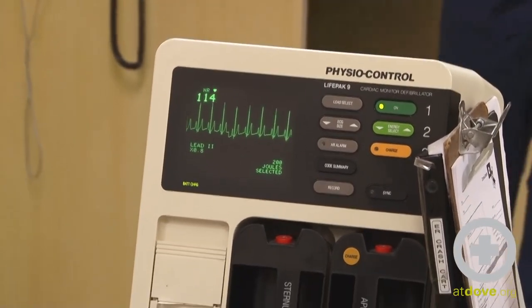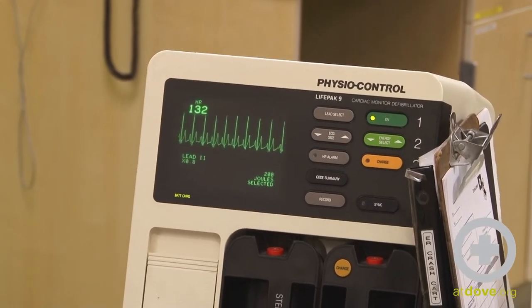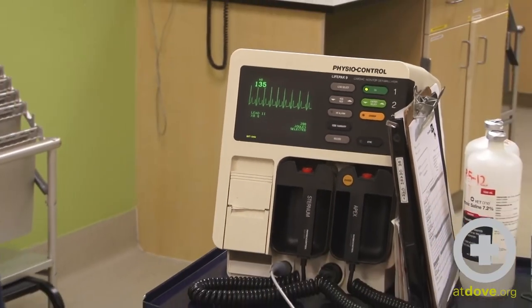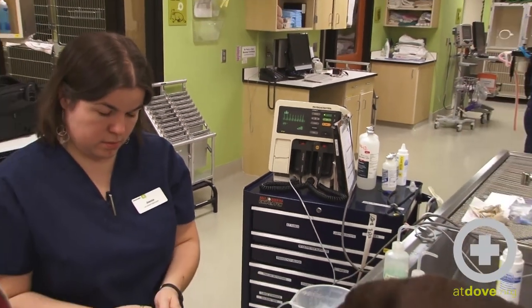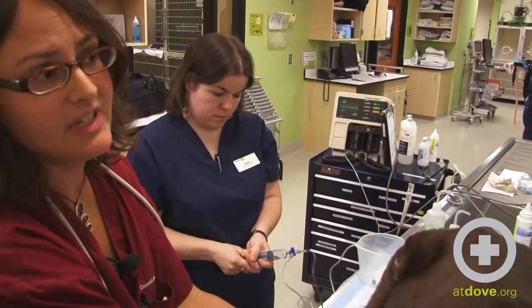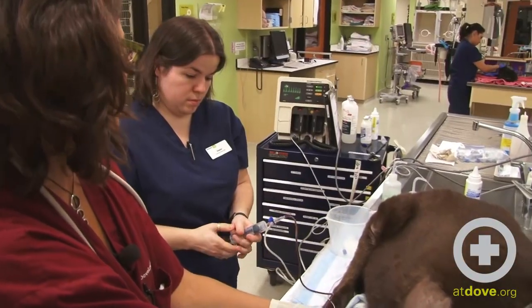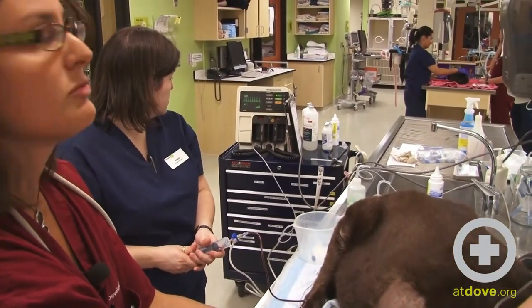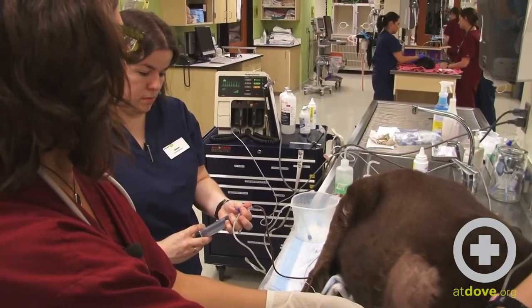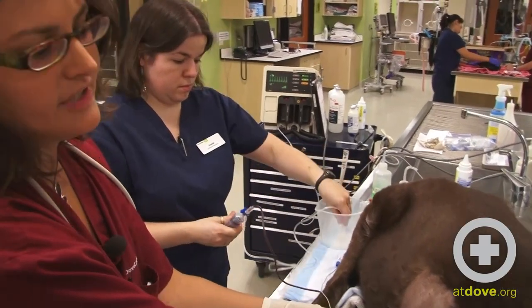We always have an animal on a continuous ECG — first of all because it allows us to see the efficacy of our tap, since these animals typically present tachycardic, and as we effectively remove some of the blood from the pericardial space their rhythm will decrease. Most importantly, if you are physically touching the myocardium you will see arrhythmias on the ECG such as VPCs. If you see anything like that you need to withdraw your catheter immediately because you're a little too close to the heart. Using the large gauge catheters, we do at times just tear a hole in the pericardium and don't actually remove a lot of the fluid physically, but that fluid goes into the pleural space where it will be reabsorbed and is no longer causing tamponade in the dog.